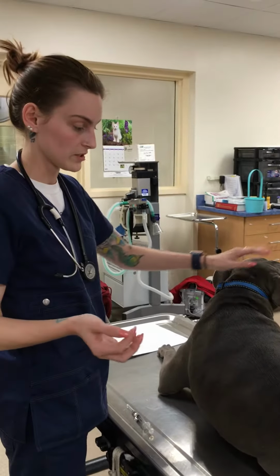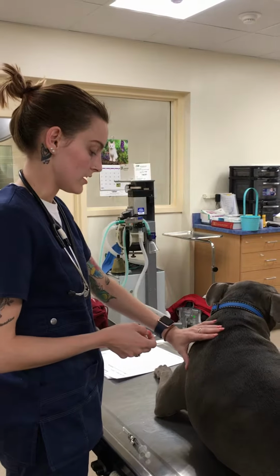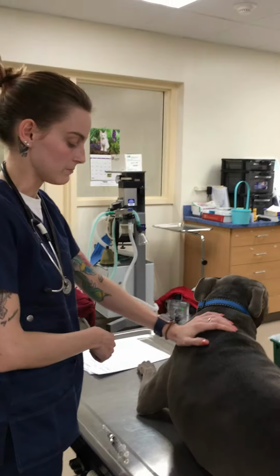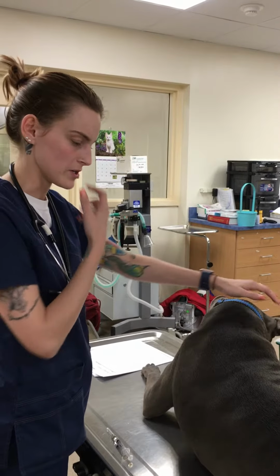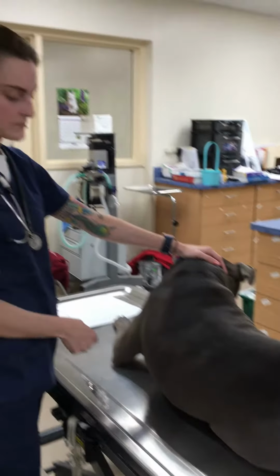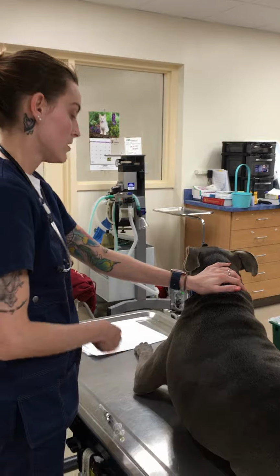So for the last video with the dog, I'm going to show how to give a subcutaneous injection, and the spot I've chosen is up in her left shoulder area. Typically that's where I would go, or I would go in her hindquarters as well for other antibiotics too, but I like to save those for if they need IM injections.